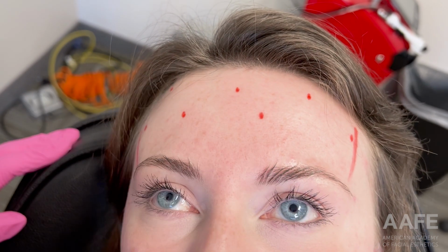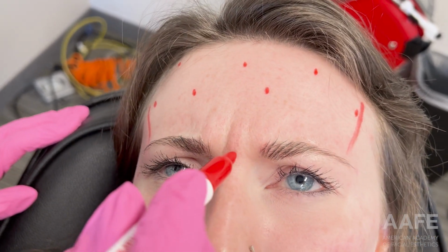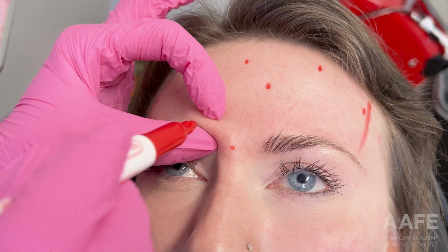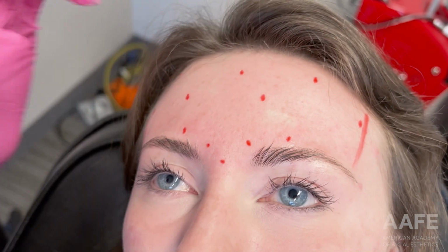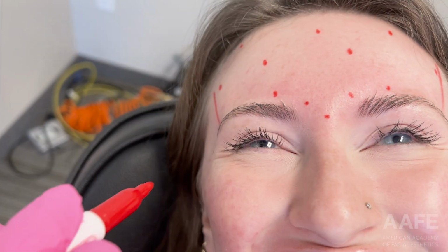I'm not doing too many injection sites on her and not doing a lot of neurotoxin just because she doesn't have a lot of movement. So we don't need to go overboard there. I'm marking up her glabella, so her procerus, and then 2 corrugators.